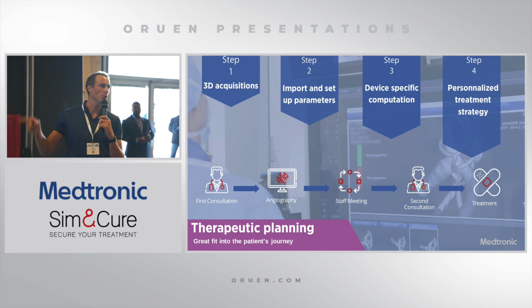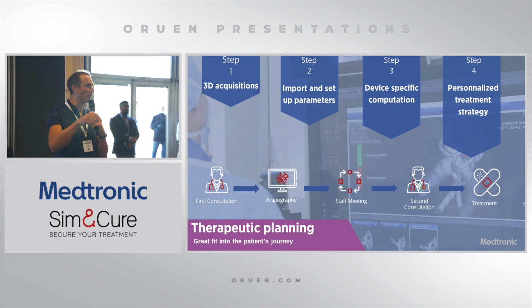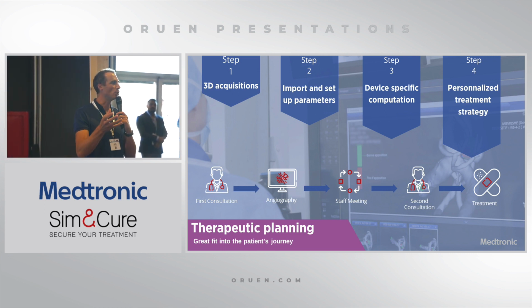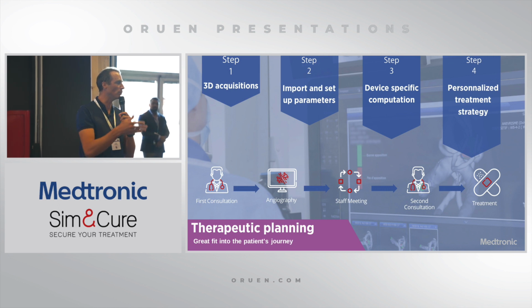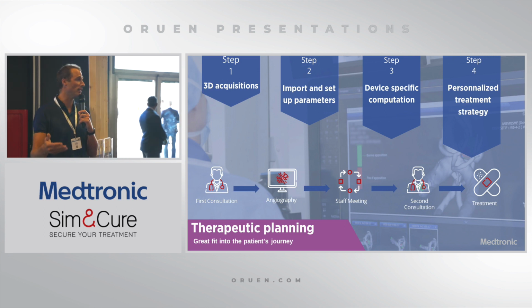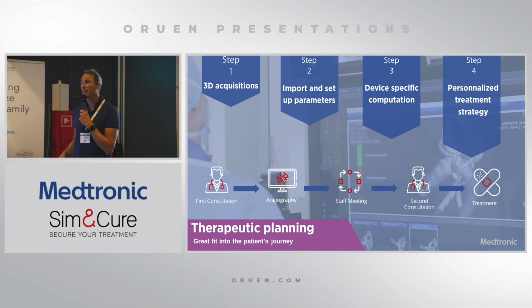And we also use this interface to show to the patient, not with a drawing. I used to make drawings. Now in the 3D of the patient, you can show what type of implant you will insert into the patient, in what location, and what is the reason for that, what are the risks related to this or this procedure. That's what we are doing, also at the desk with the patient.